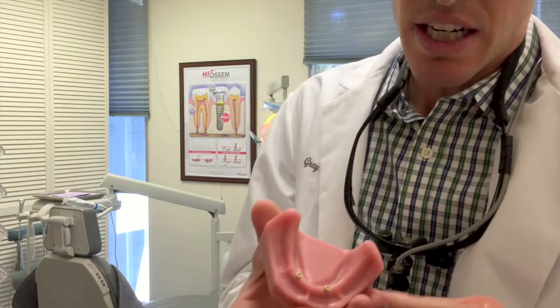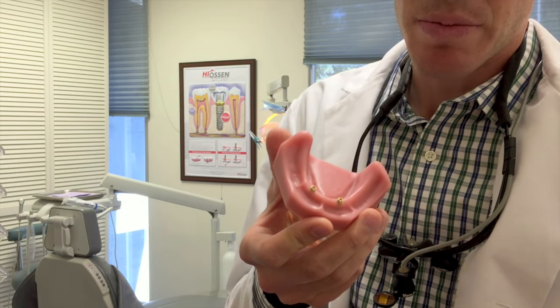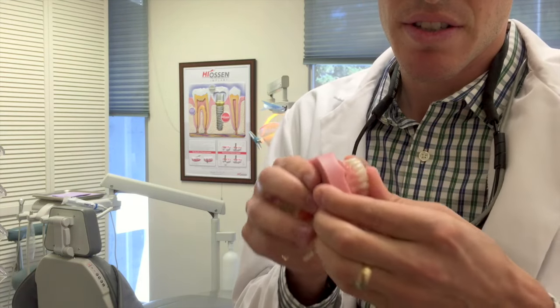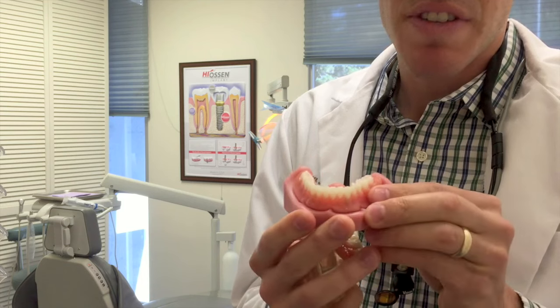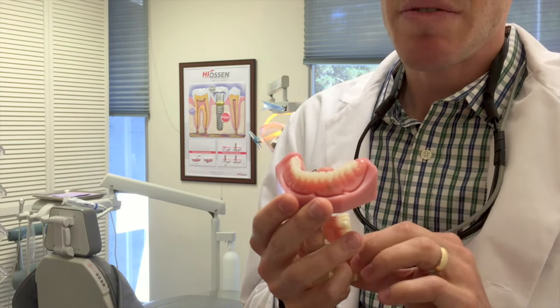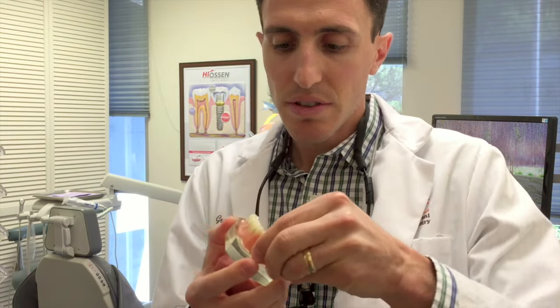As you can see, there are two different locator attachments that connect to the bottom of the denture, and this snaps into place and is very sturdy — a great way to do it. However, you can get even stronger support another way, which is a bar.